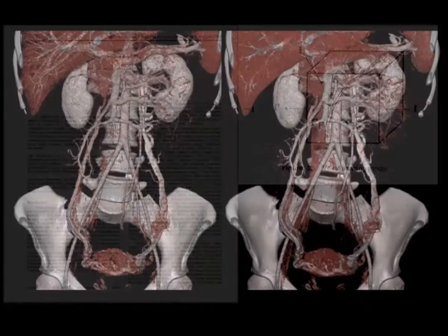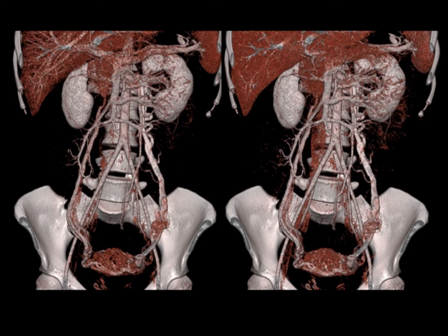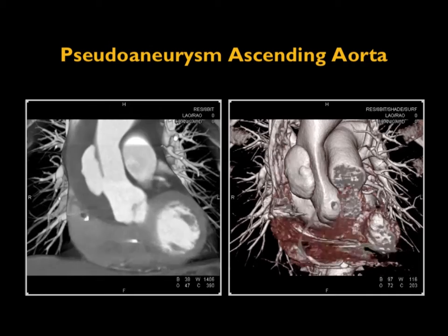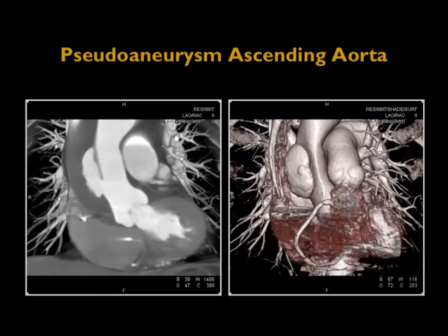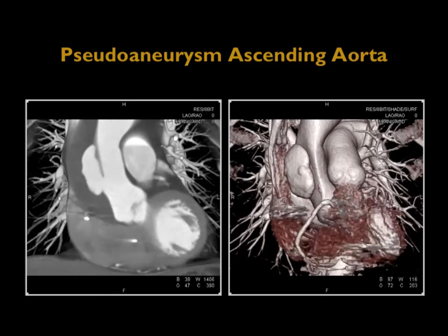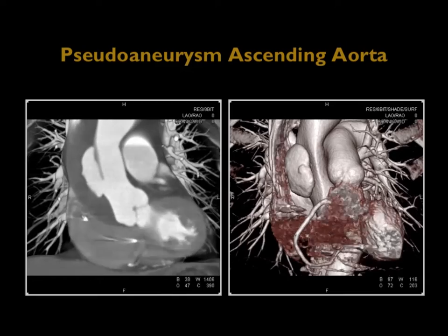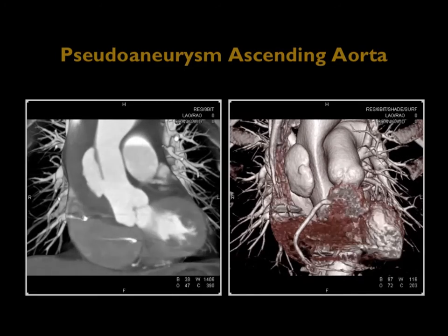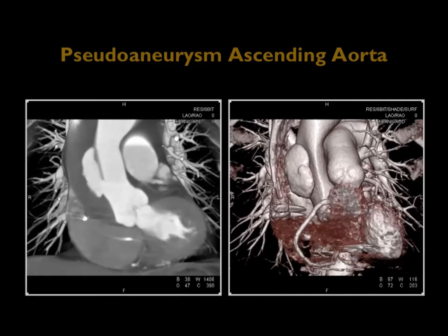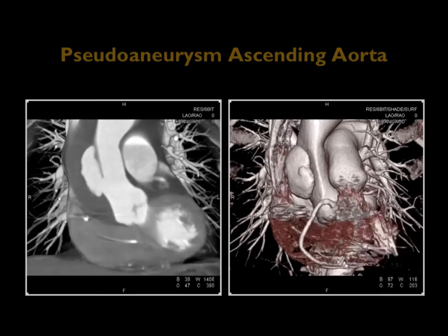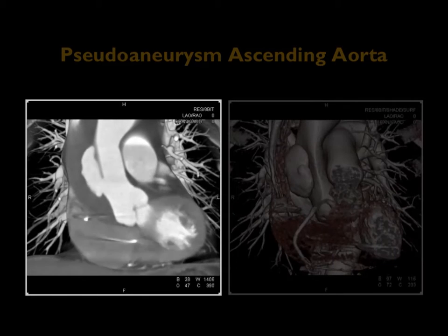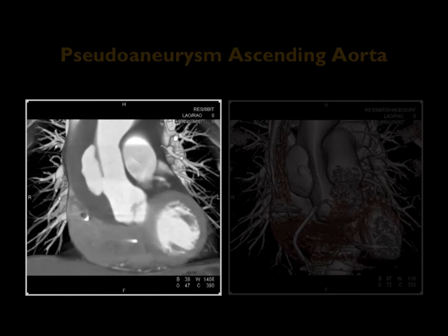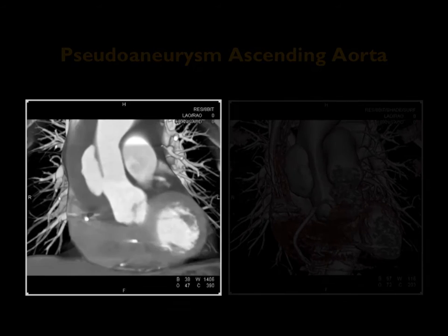With volume rendering you typically have one light source but you can use it very well. Here I'm showing you the aorta and the veins, the gonadal veins, the kidneys, the liver, or the patient's vessels of the heart with a pseudoaneurysm. Particularly on the image on your right with the color coding, you get a very good feel of the shading models and lighting models that give you a three-dimensional feel compared to the MIP projection on your left.